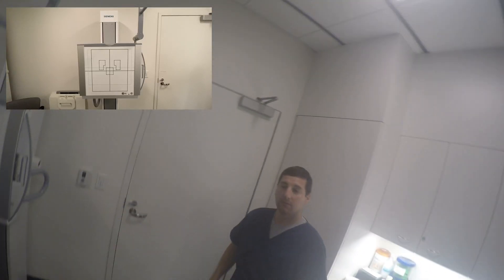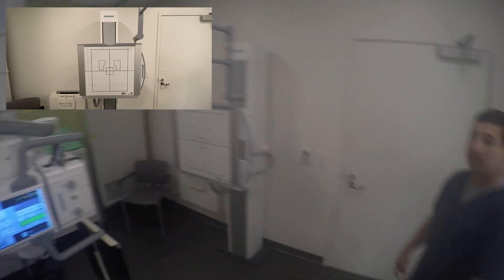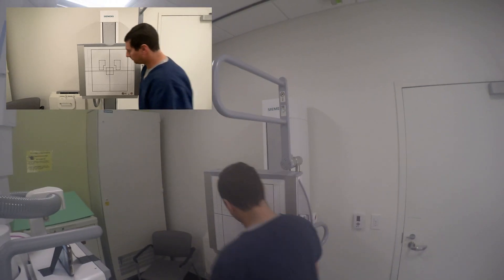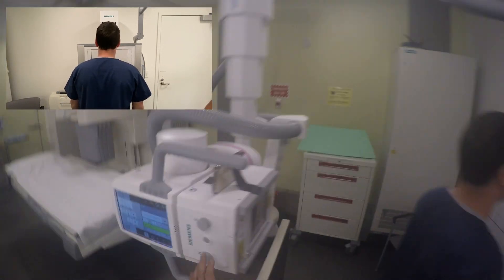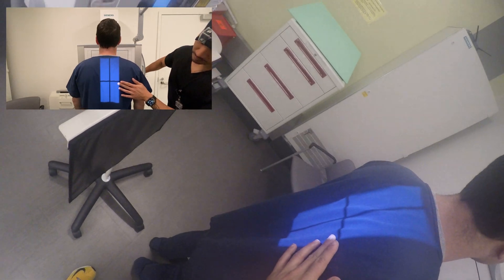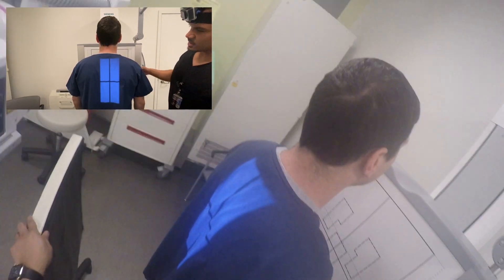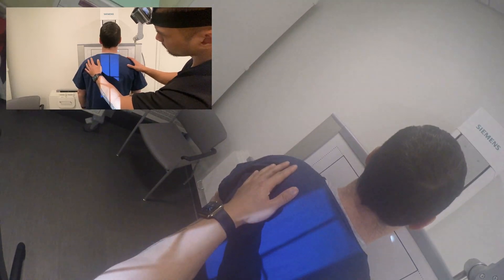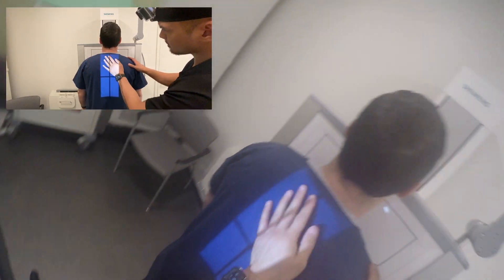All right sir, so we're looking at your upper back, correct? Yes. All right, cool. So I'm going to have you stand over here. You're going to be facing the board. Let's get everything lined up to your height here. Chest all the way up against the board there for me. Good, so very still there.